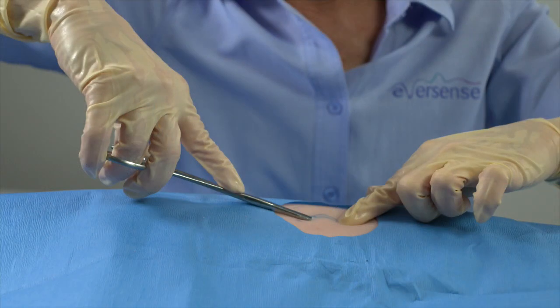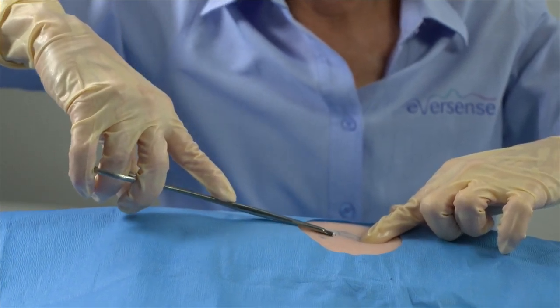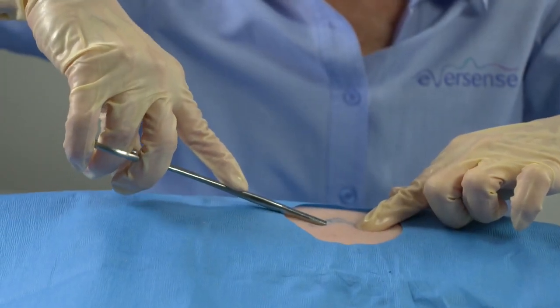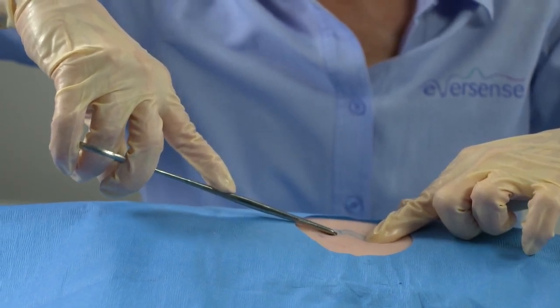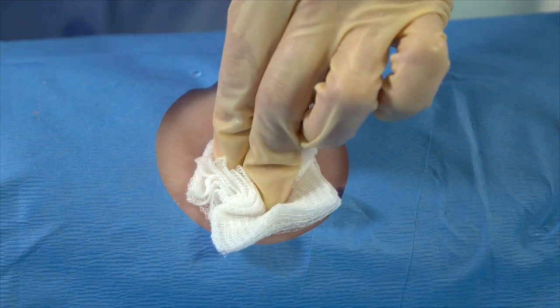Do not, however, use the locking mechanism. Instead, use gentle pressure to secure the sensor, then withdraw the clamp and sensor from the incision line. If you experience any resistance, gently rotate the clamp with the secured sensor to release any small fibrous tissue. Then apply gentle pressure to the incision line with sterile gauze for several minutes to stop any bleeding.